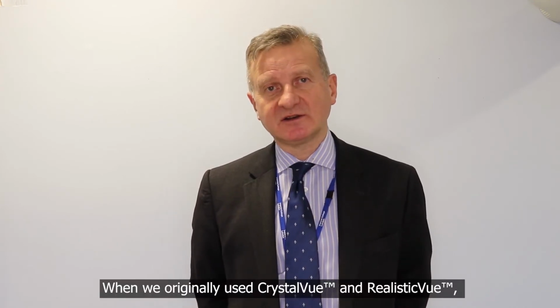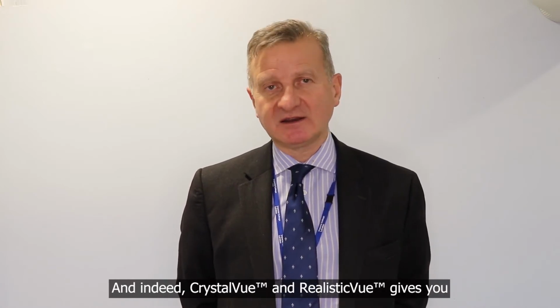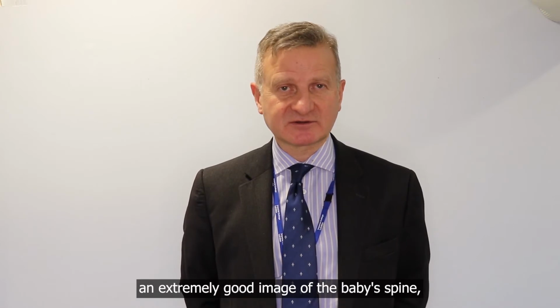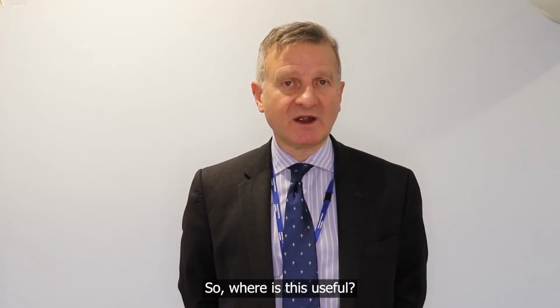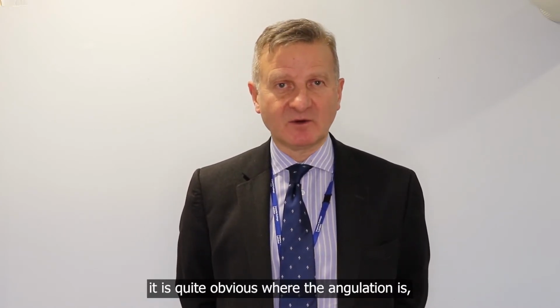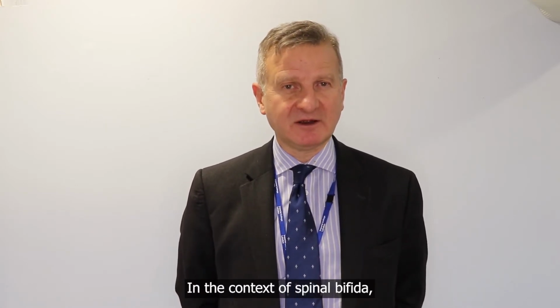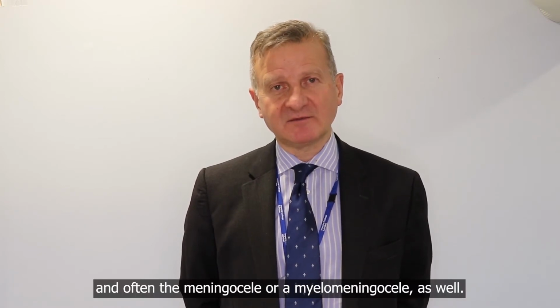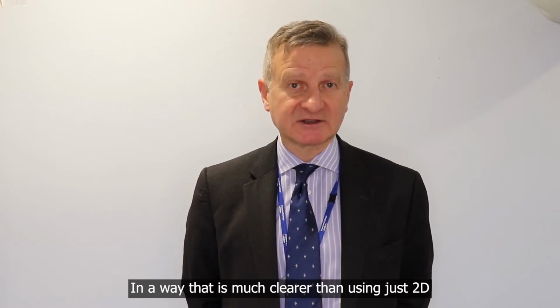When we originally used CrystalVue and RealisticVue, we were very interested in looking at babies' spines, and indeed CrystalVue and RealisticVue gives you an extremely good image of the baby's spine, either sagittally or coronally, and you can see the baby's ribs as well. So where is this useful? Well, in the context of a kyphosis or scoliosis, it's quite obvious where the angulation is, and we might see a hemivertebra, for instance. In the context of spina bifida, we can see the bony lesion and often the meningocele or myelomeningocele as well, in a way that is much clearer than using just 2D or conventional three-dimensional ultrasound.